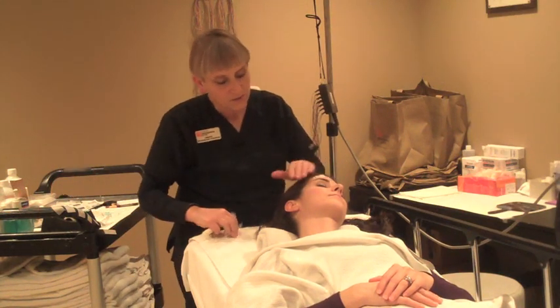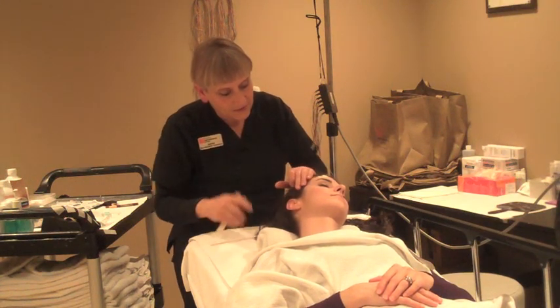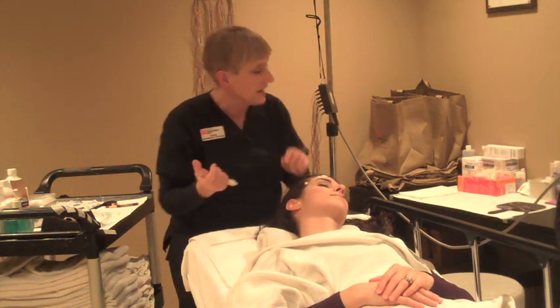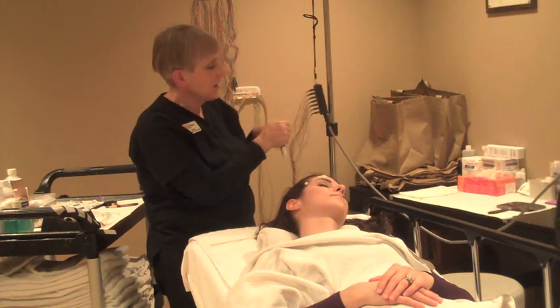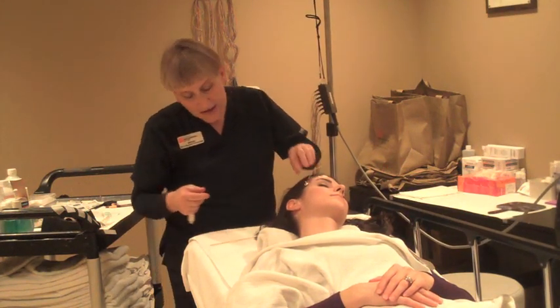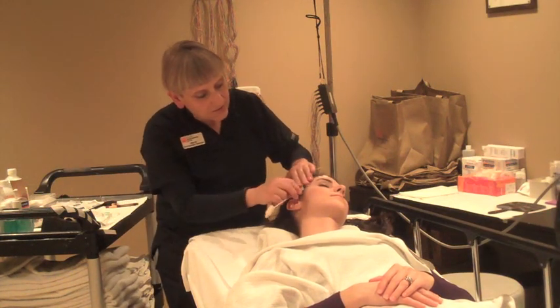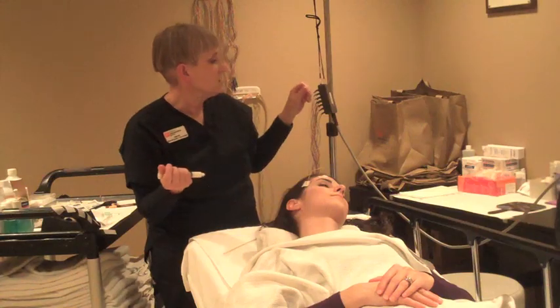So that's how we start to put the wires on — there are quite a few of them. It usually takes about 10 to 15 minutes to get all the wires on your head, and then the recording will be a half hour. During that recording we'll just turn the lights down and have you relax as much as you can.